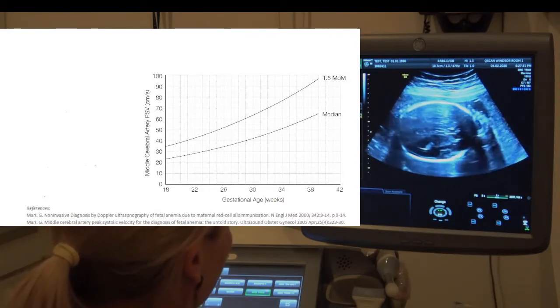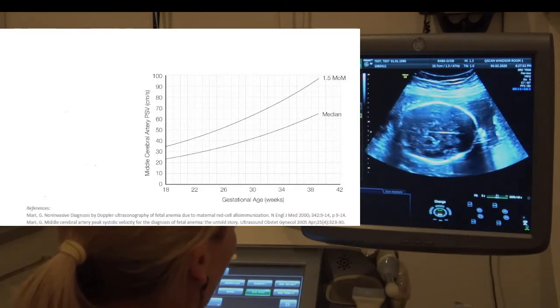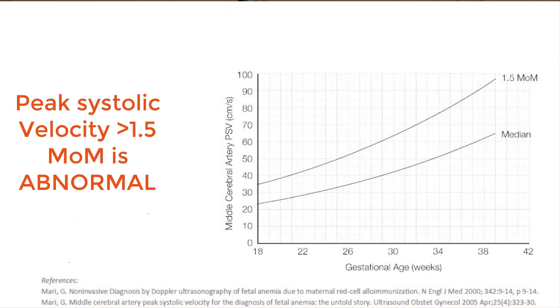If you have a PSV greater than 1.5 MoM, and of course you're not going to know that until you get into your charts, that's abnormal. But a really easy way when you're scanning is to double the gestational age in weeks, so say you're 25 weeks and you double that, that's 50. If the PSV is greater than that, then it is most likely going to be greater than 1.5 MoM. So that's abnormal. So that's a good little trick when you're in the room.